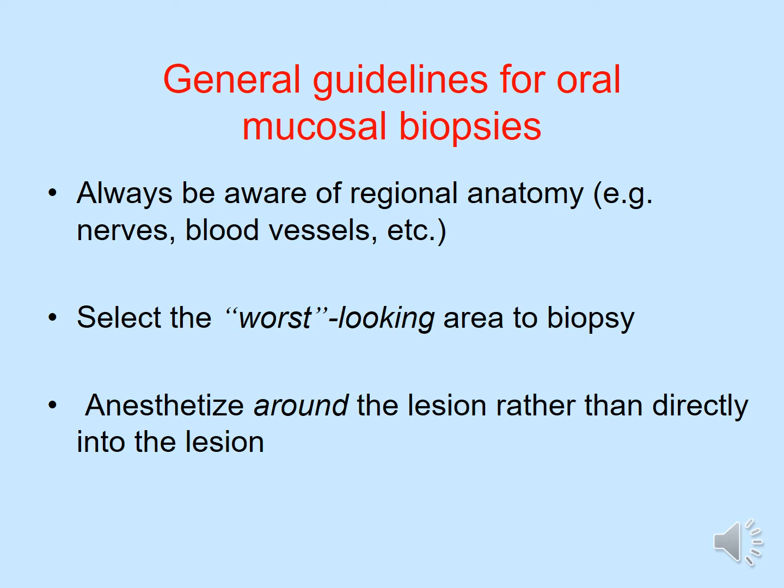So let's look at some general guidelines for oral mucosal biopsies. Mucosal biopsies are among the most common biopsies done in dental offices. First of all, we always need to be aware of regional anatomy. That means you need to be aware of the nerves, the blood vessels, and any important structures present in the vicinity of the lesion. Then we select the worst looking area for the biopsy.